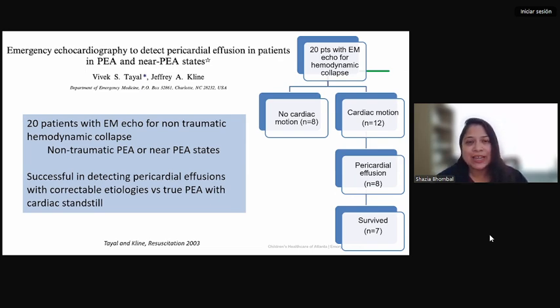We're not trying to diagnose congenital heart disease. We're not trying to diagnose major pathologies other than ones that we can potentially triage and treat faster.